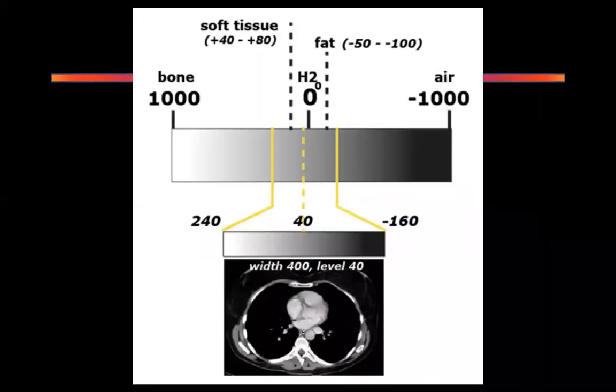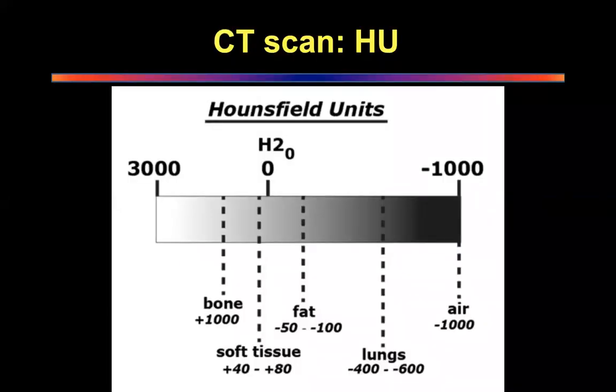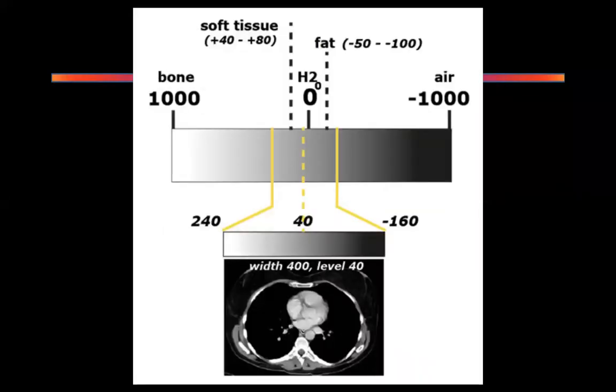What most people really do not understand is what a lung window is. If I ask them to explain a lung window or a mediastinal window, they cannot explain it in terms of Hounsfield units. So, very clear cut, -1000 to +3000 is the range of the color. The human eye cannot detect all of this range of color. Hence, you have to narrow the window so that the human eye can see specific structures.